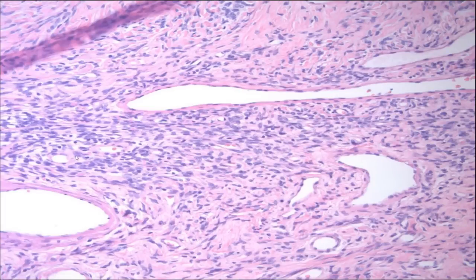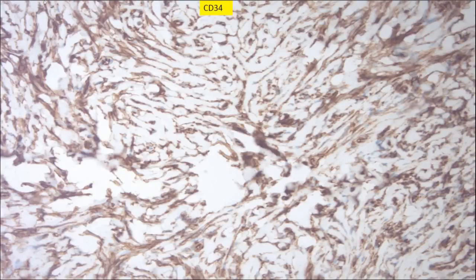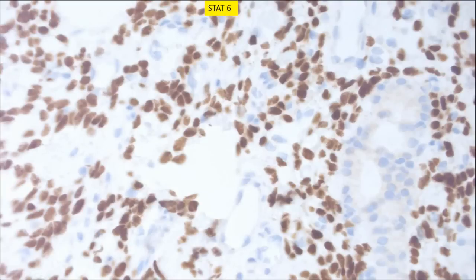So alternating areas of hyper- and hypocellularity, very bland, minimal mitotic activity, and no necrosis, and strongly positive for CD34, and strongly positive for STAT6. So this is an example of a sinonasal solitary fibrous tumor.